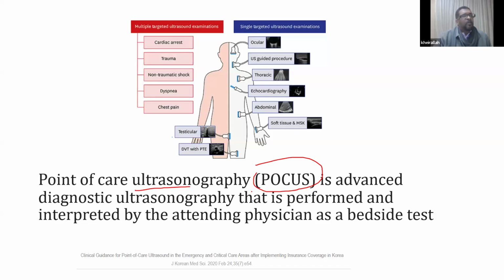Okay. Remember POCUS, now there are courses for POCUS, by the way, point of care ultrasound, not only in echo, but everywhere. So POCUS is the point of care ultrasound. And now, as I showed you, there is a pocket device. You can mount an entire software of ultrasound echo on your mobile. So it is clearly POCUS. You can do it wherever.